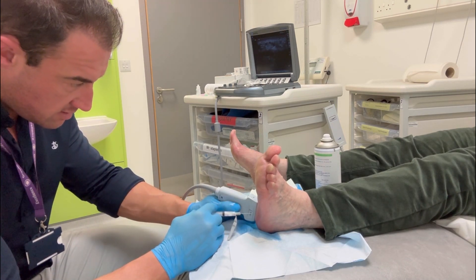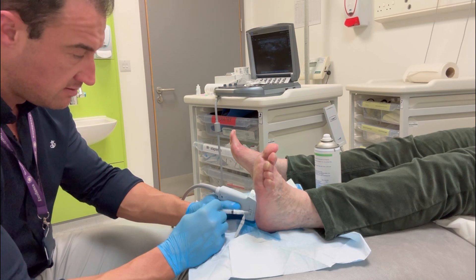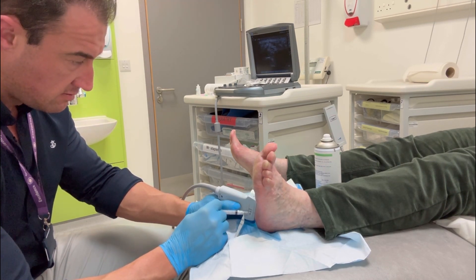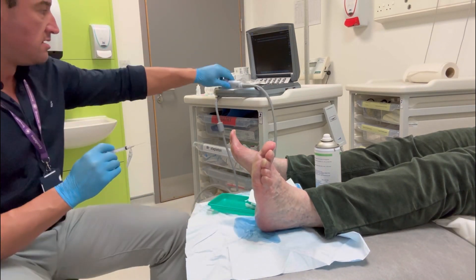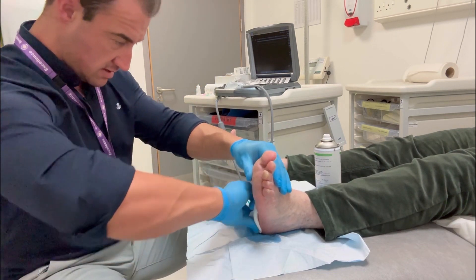We're utilizing the ultrasound for accurate needle placement, and you can see on the ultrasound scan that the needle is at the area of maximum thickness of the plantar fascia. Thank you for viewing — if you have any questions, please ask.